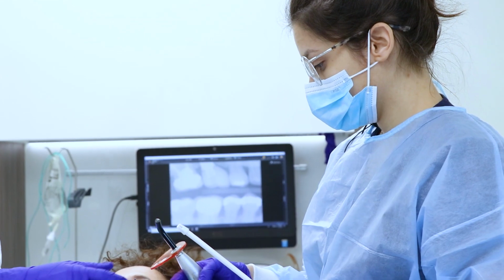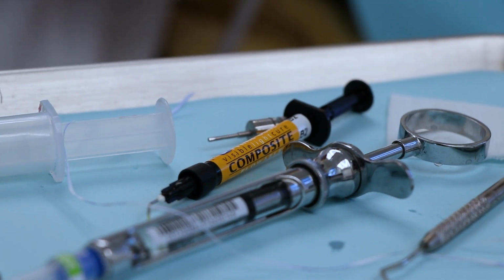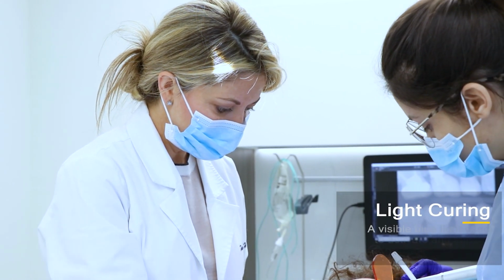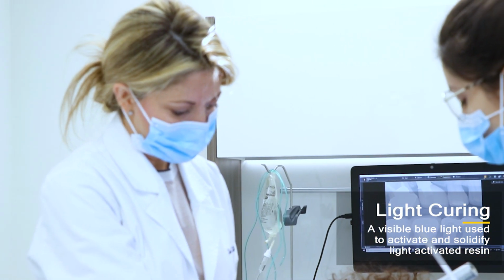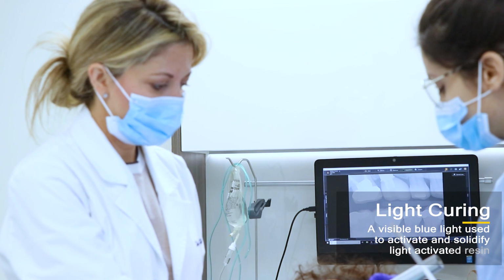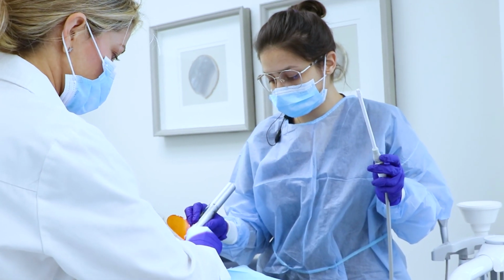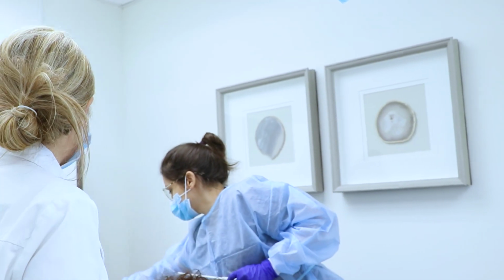And now we just cover the access hole, which is the screw hole, with resin composite. I use a flowable material, and it's light cured. It's blinking. And check the contacts again. You should hear that little snap.